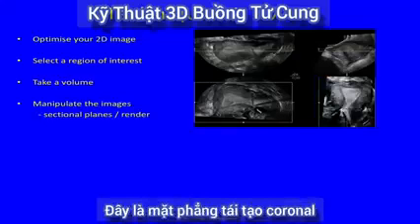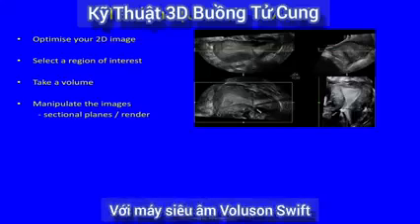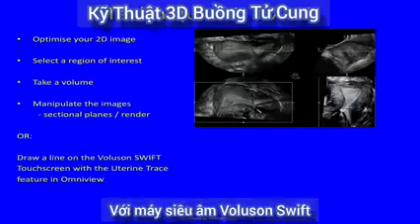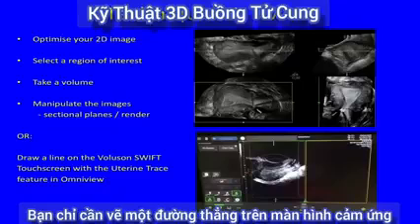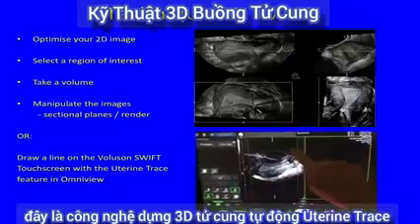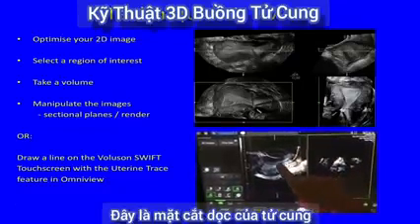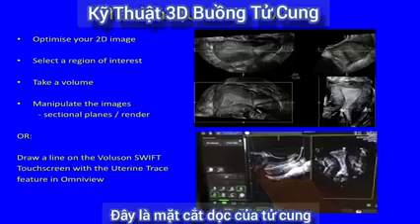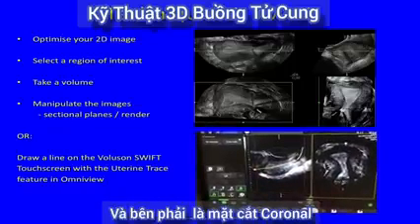This is the rendered coronal view. Or what you can now do is draw a line on a touch screen using the uterine trace feature in OmniView. There's the longitudinal view of the uterus and there is the coronal plane.